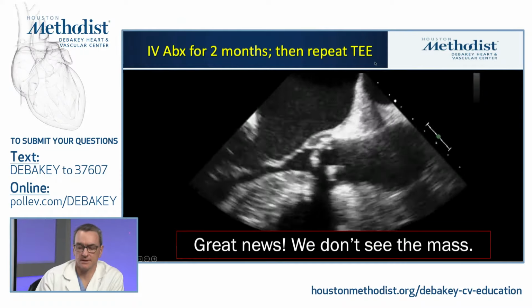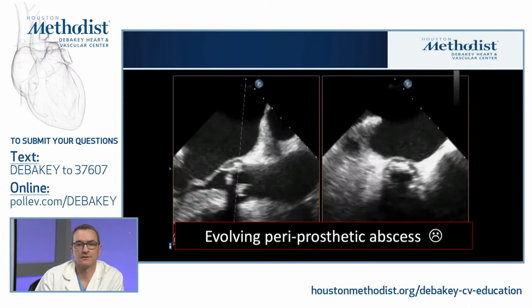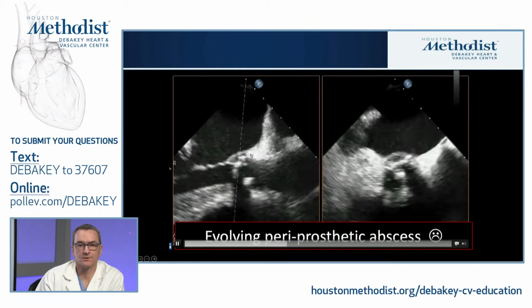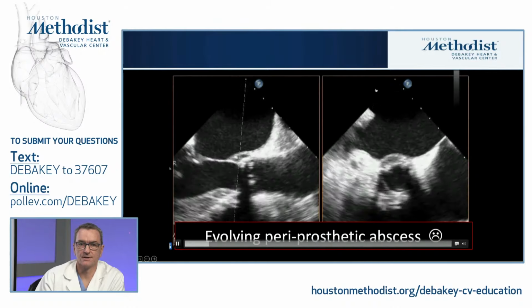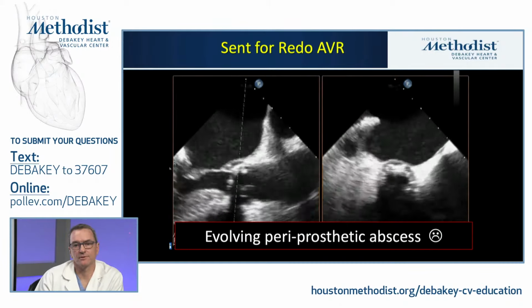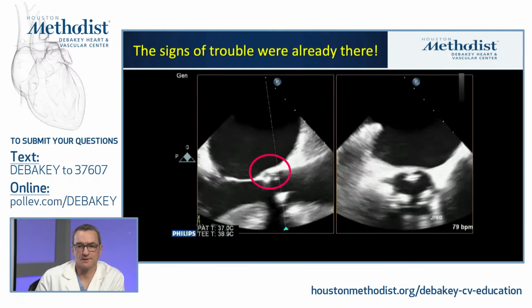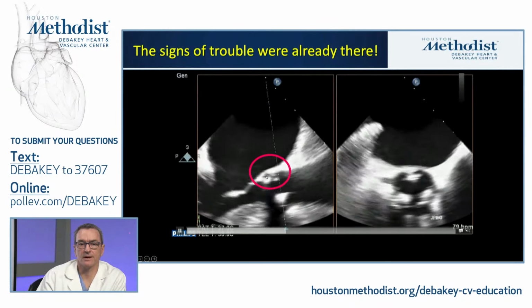Well, if you look closely again for the potential complication of a bioprosthetic valve infection, you see that there is a periprosthetic abscess evolving, shown here, sort of the very specific area of sort of lucency on echo. You see it in 2 orthogonal views. So that's a periaortic abscess. That is not going to clear with any form of IV antibiotic. Patient was sent for a redo surgery. But if you look back at the initial echo 2 months prior, you can see that it was really there already.